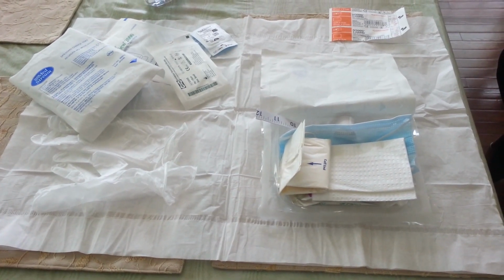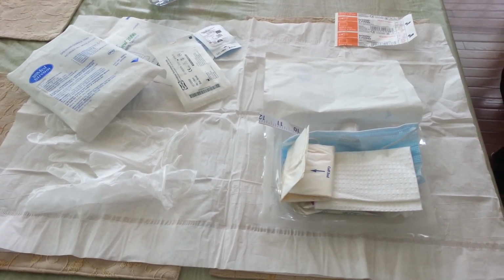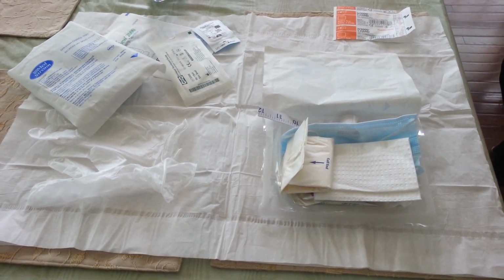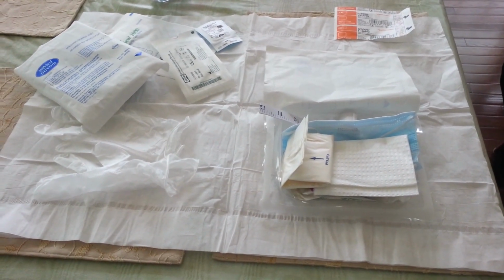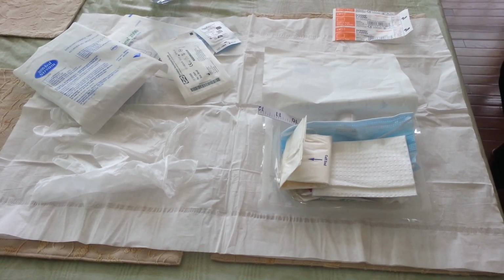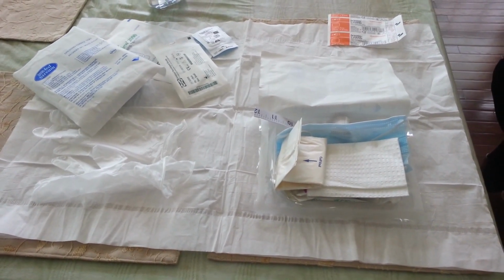Today I will share with you how we change the dressing on my Picc line. I do it once a week unless I need to change it sooner for any reason. Initially we were nervous about doing it on our own, but gradually with practice and observation, it now seems very easy. I feel more comfortable and at ease since we started doing this ourselves. It is critical to maintain sterility during this process and also to ensure that the catheter does not migrate out accidentally while cleaning the Picc line site.